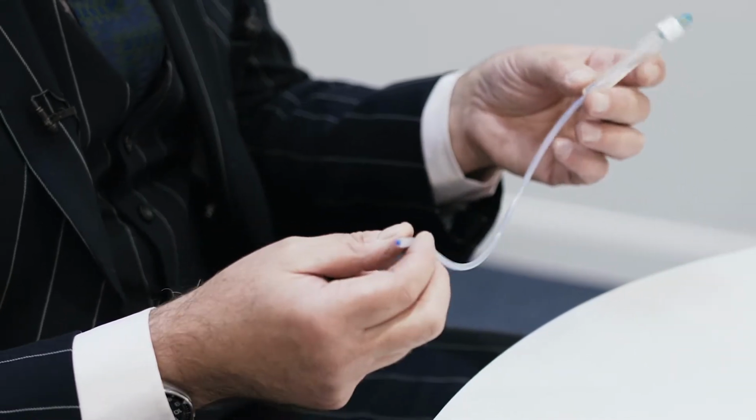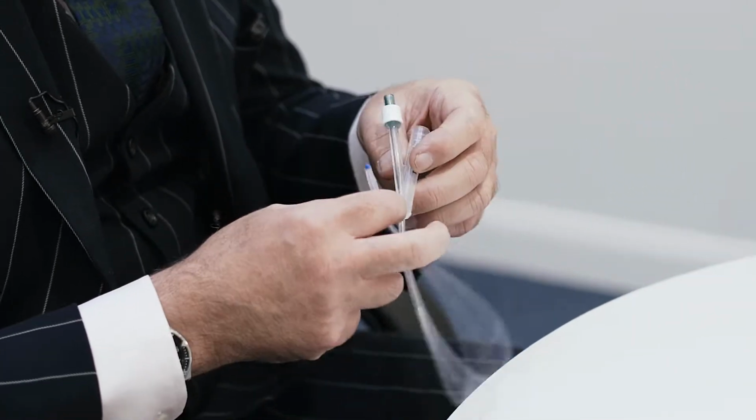So this is a urinary catheter. They come in various sizes, lengths, and made from different materials, but this is a fairly standard catheter which would be introduced into patients either urethrally or from a suprapubic catheter into the bladder. When the catheter is first introduced, it has a clean surface and urine is sterile, and therefore it has no difficulty in draining.